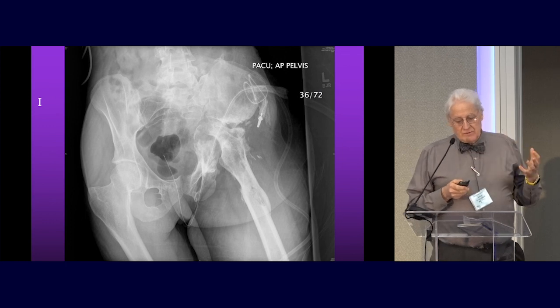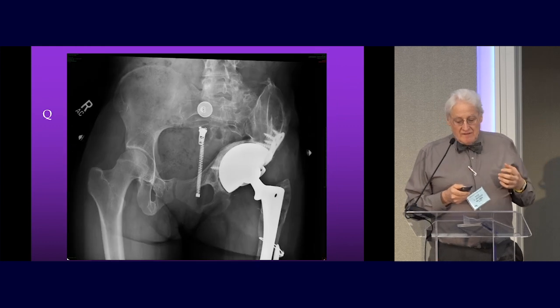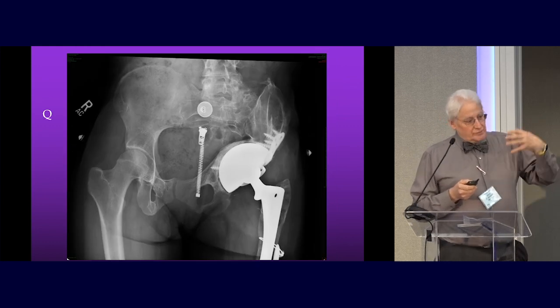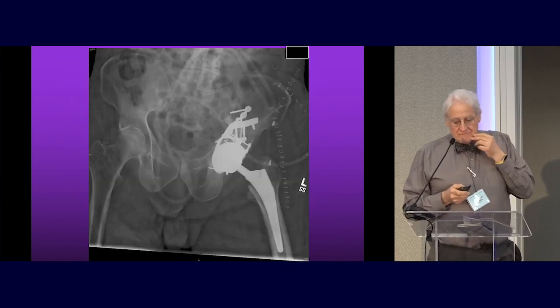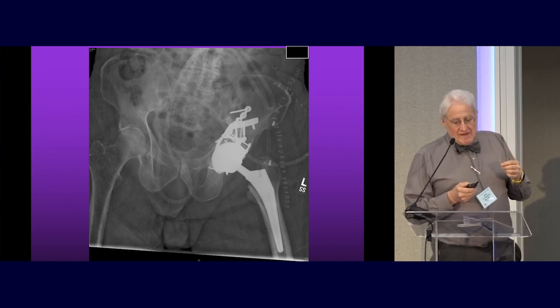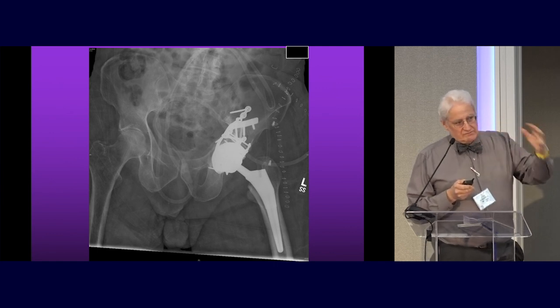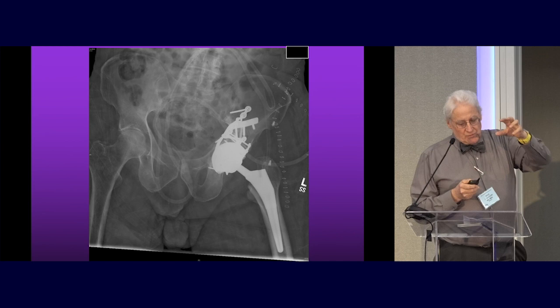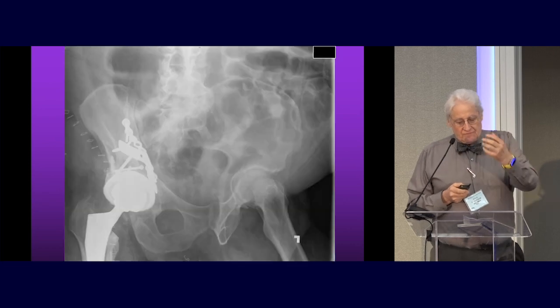So here's an example of a different kind of case, but it's a contained defect. And again, I use a jumbo cup, put a cage inside of it, and then cement a cup into it. And I've restored that hip center to the right place. Another one that I had to put more of an allograft in, so I had to fix it. And then this is maybe a little bit older because I used one of those, we called it a Lone Star plate. Then I put a recon plate over it to buttress it. The idea is that that prevents the hip from going medially.